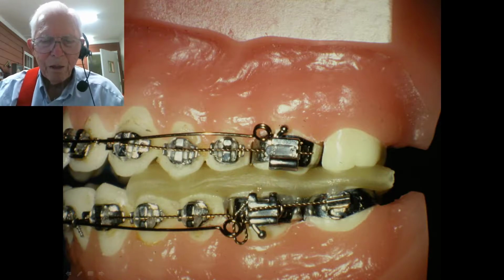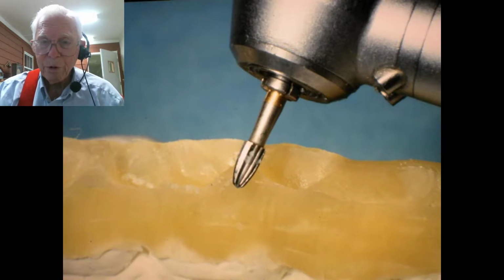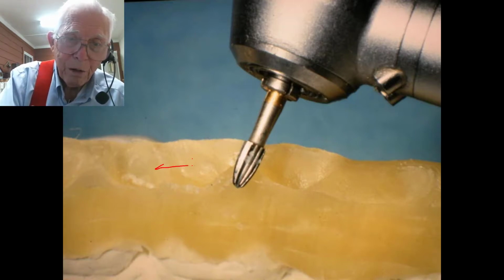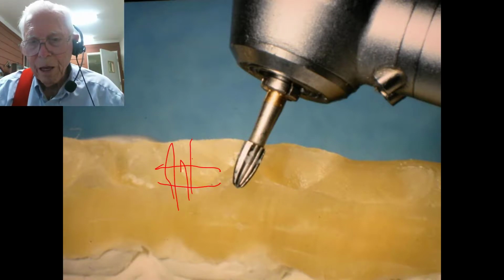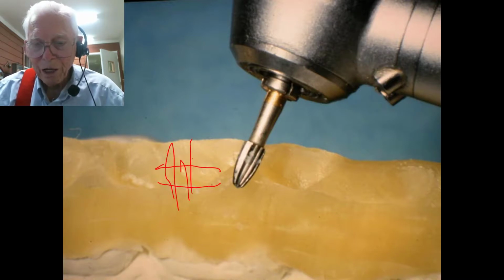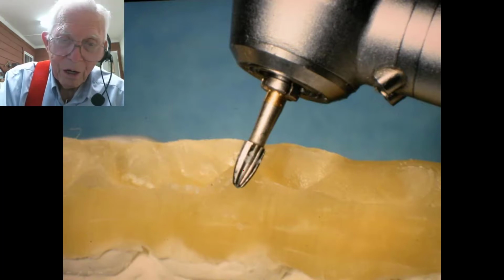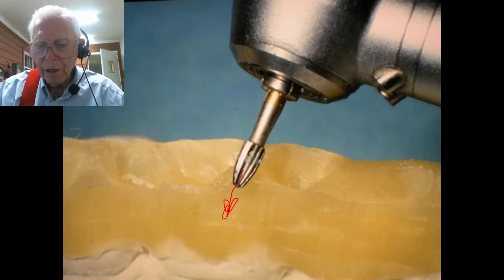So making the block, there's a lot more to it than just hardening a piece of acrylic between the teeth. So here we hardened it up, and we can come in and grind the edges, make it kind of smooth. Now when you get ready to do this, you take this off. You take this same burr and just cut a groove down in the middle of this and mash it together with a set of pliers or something, and you can pop one side off easy and the other side's kind of weakened, and you can work it and cut between them, and you've got a different color. When you get close to the tooth, you can see it when you're grinding that off there.